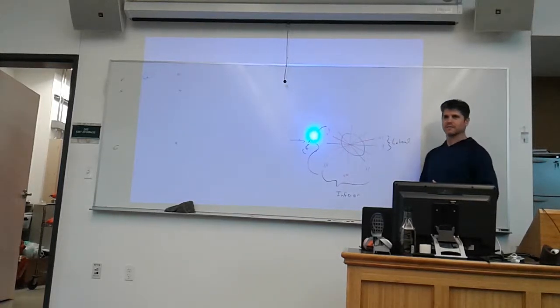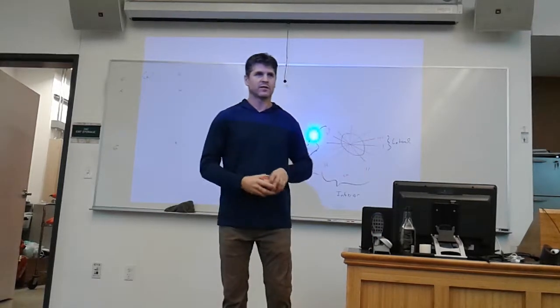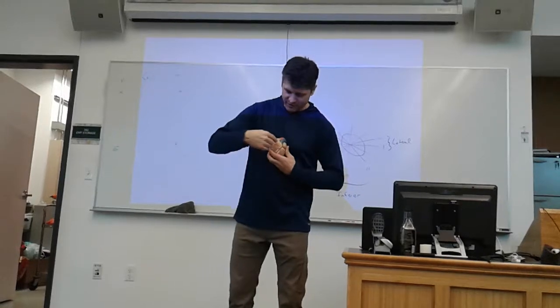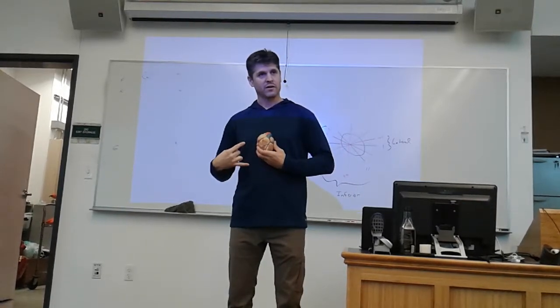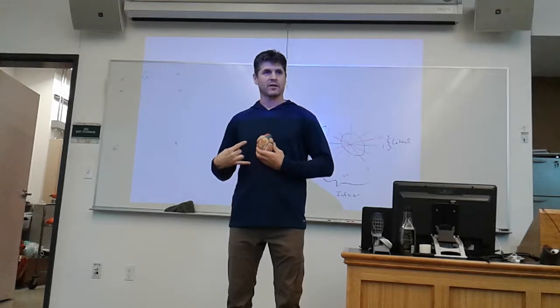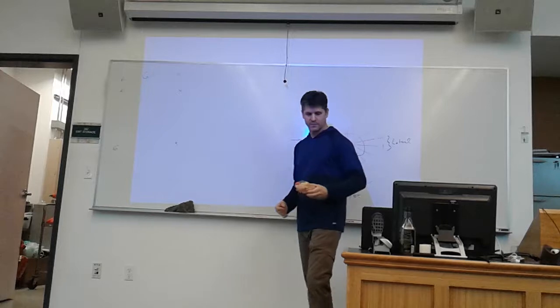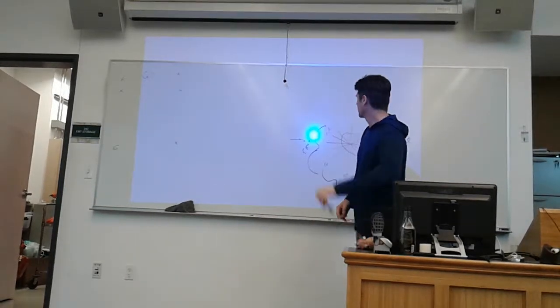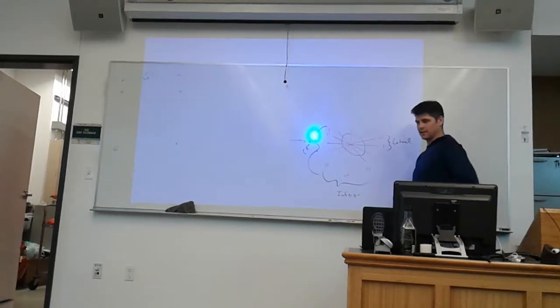Does that make sense? Why is that not medial? Where is medial? Towards the middle and it kind of goes down. Yeah, the medial is in the middle. And these leads are over here. So what part of the heart are they looking at? The right side. Okay. So those are all of our limb leads.